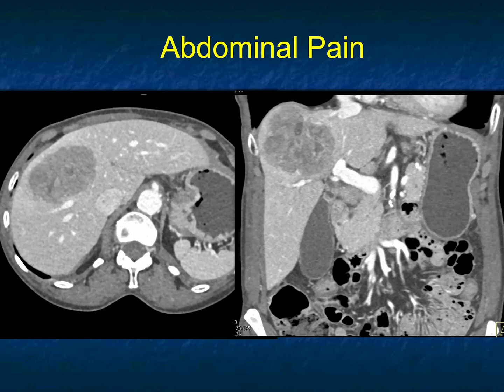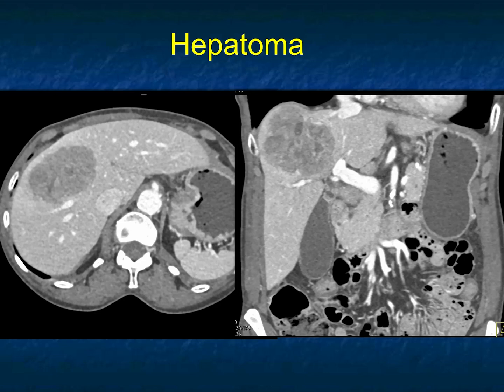It looks more like a primary hepatic tumor, be it a cholangiocarcinoma or hepatoma. It also could be a metastasis. It doesn't have the cystic changes of an abscess. This was a hepatoma. Sometimes you have hepatomas in non-cirrhotic livers — this liver really doesn't look cirrhotic. Probably 80% of hepatomas you'll see, the liver will be cirrhotic. That can be a helpful way of distinguishing between hepatoma, cholangiocarcinoma, and perhaps metastasis.